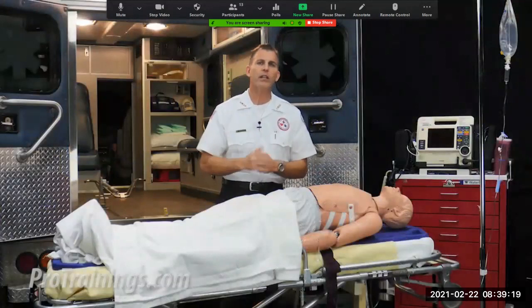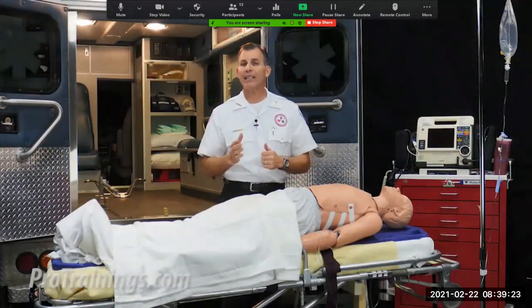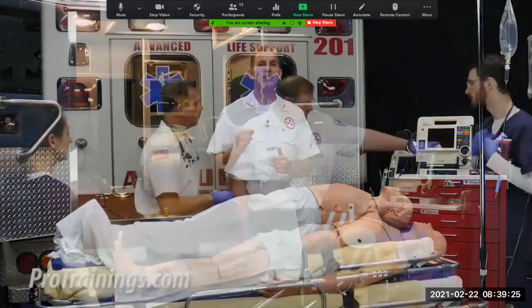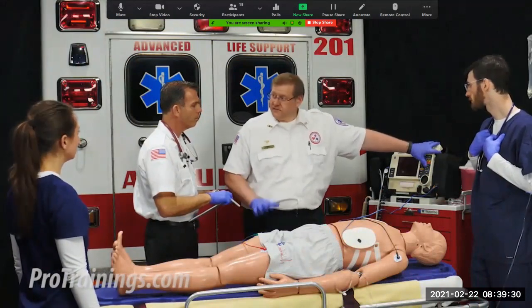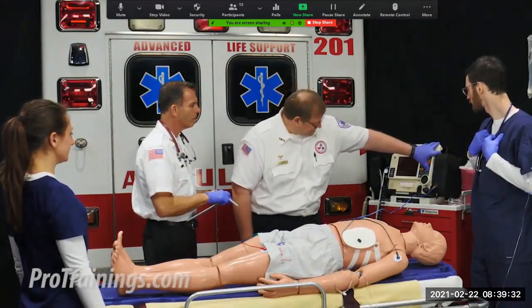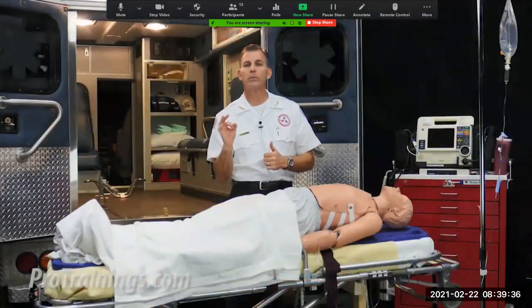Protocols will dictate and vary from place to place. However, the American Heart Guidelines recommend that we start at 60 beats per minute. And as the pacer is running, we turn up the milliamps until the heart muscle is captured. In our scenario, we have a consistent capture at 70 milliamps.